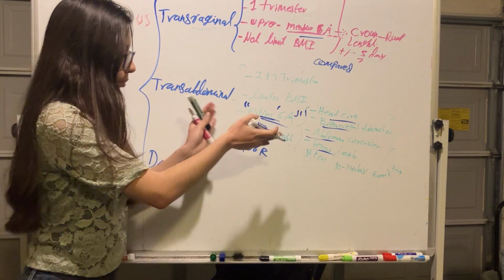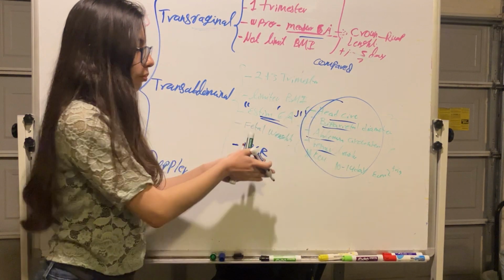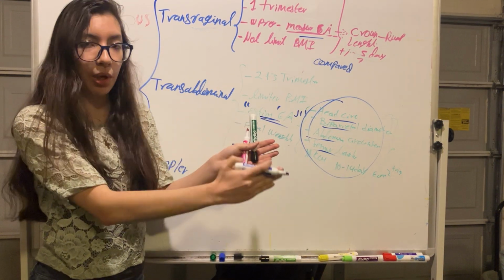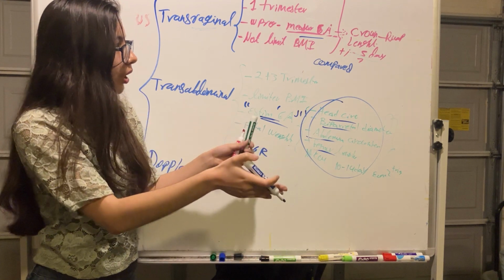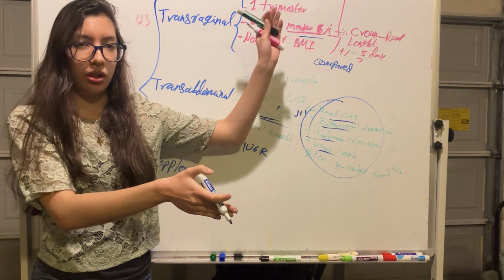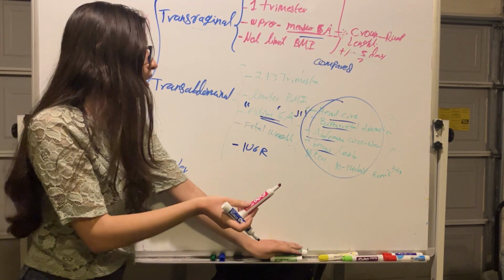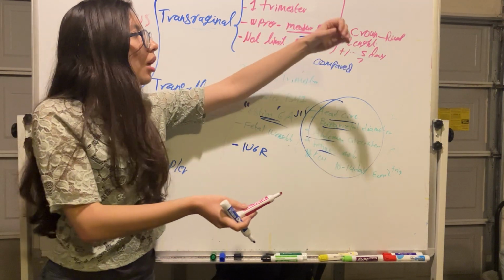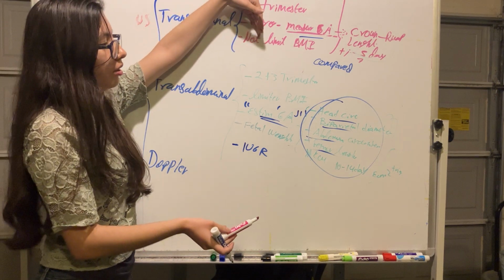With these parameters, we always are going to have an estimation of the gestational age at this point that is always going to be compared with the gestational age, or how many weeks pregnant the patient is based on the first transvaginal ultrasound that was made.